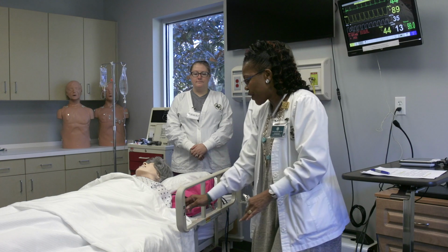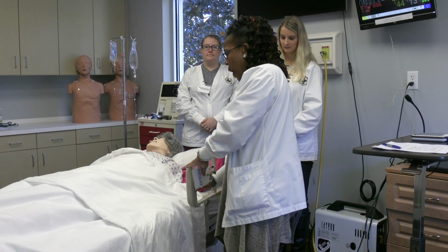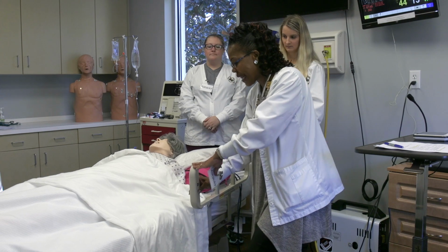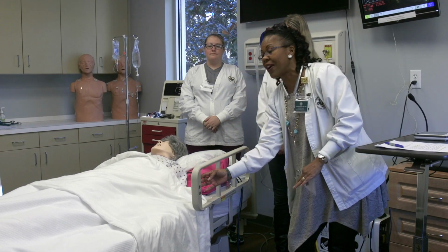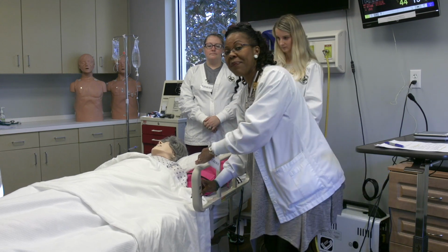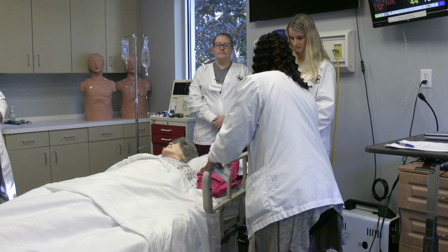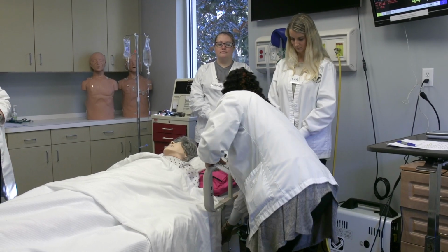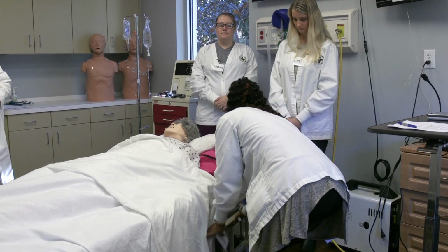On the bed rail here, you can raise and lower the bed. You want to make sure when you're doing CPR that it is comfortable, that the bed isn't too high or too low. You can also, on the inside here, raise and lower the head of the bed. Then with the bed rail itself, so that you're comfortable and able to effectively do your CPR, simply press the button on the side of the bed rail and lower it down.